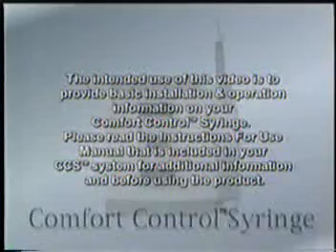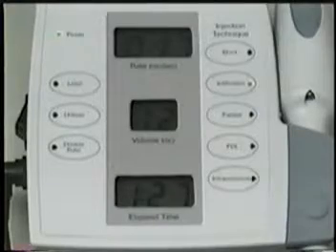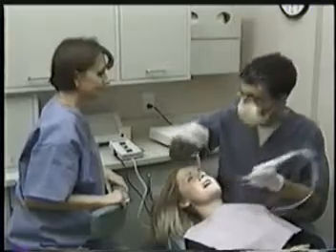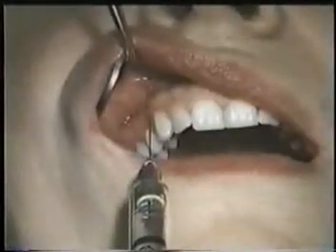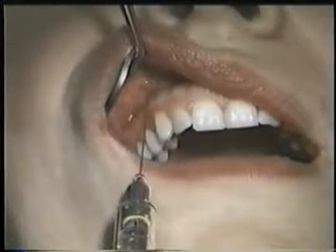the product. Your Midwest Comfort Control Syringe, or CCS, is an electronic pre-programmed injection delivery device which gives you the control you need to make your patient's dental experience as pleasant as possible. This is achieved by dispensing anesthetic more slowly and consistently than with a manual syringe.